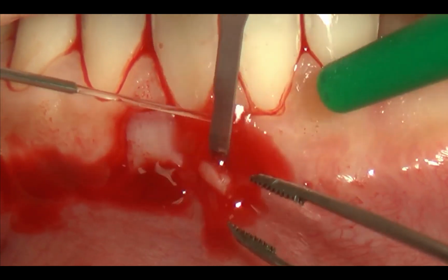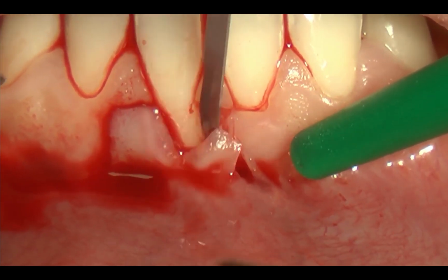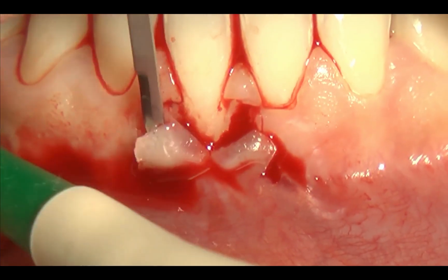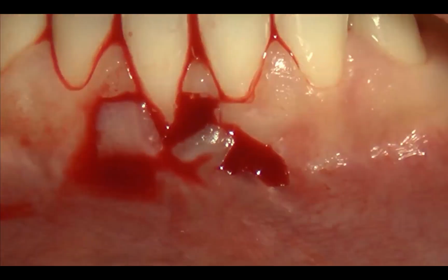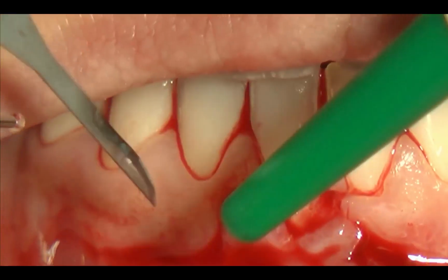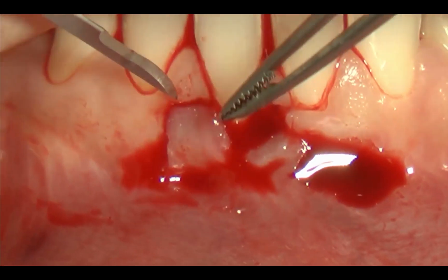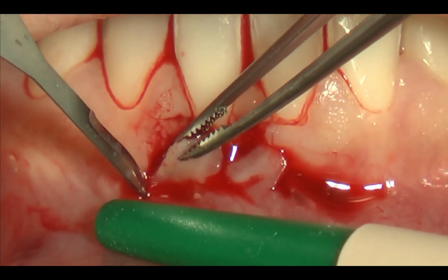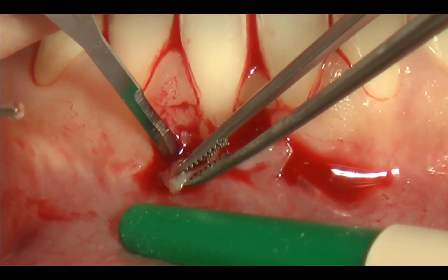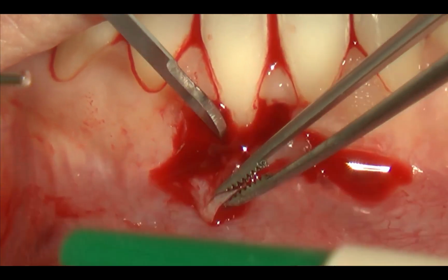Okay, this is the second surgical papilla. Very unlucky, but we were able to give it the right shape, trapezoidal, and the same is for the second one. Now, I will extend a bit more the vertical releasing incision in alveolar mucosa.